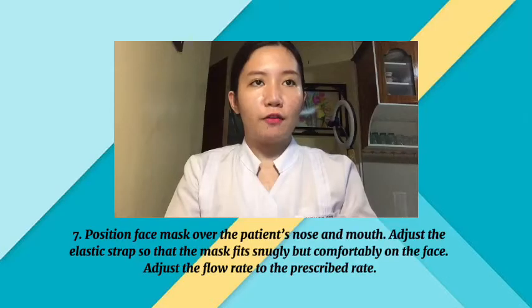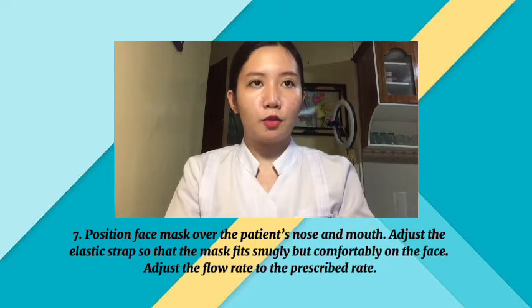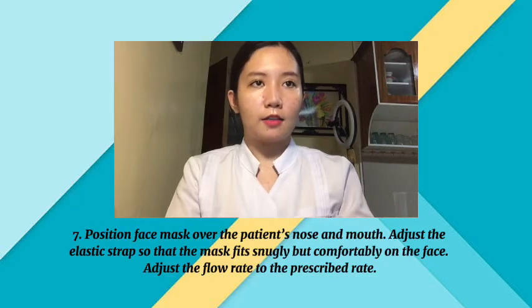Position the face mask over the patient's nose and mouth. Adjust the elastic strap so that the mask fits snugly but comfortably on the face. Adjust the flow rate to the prescribed rate.